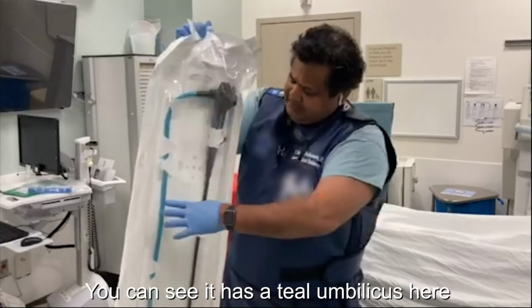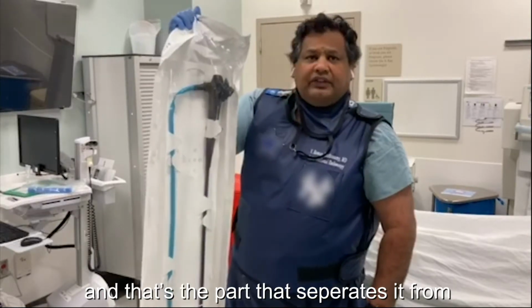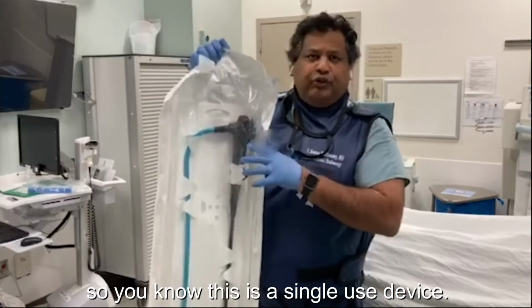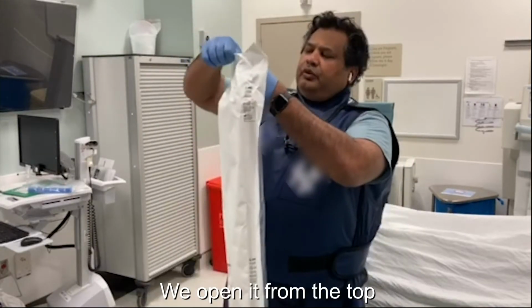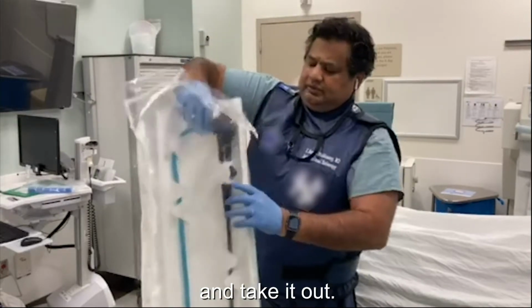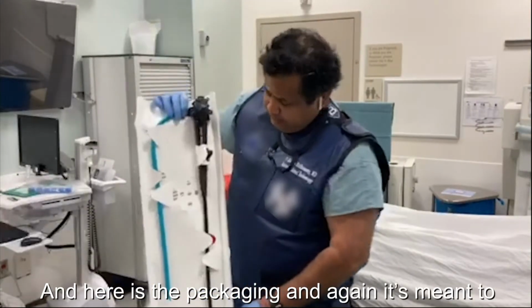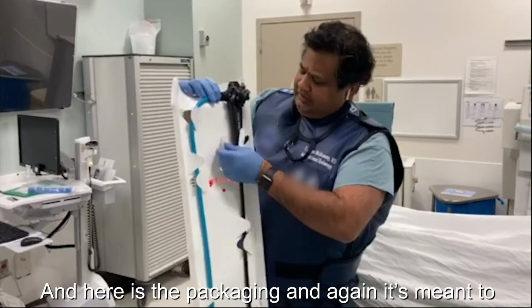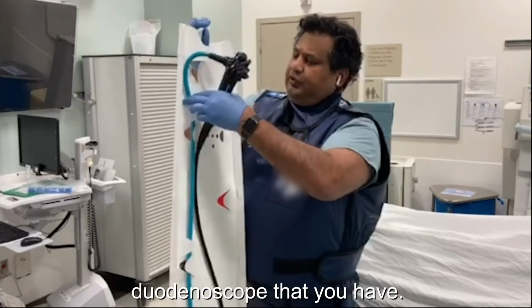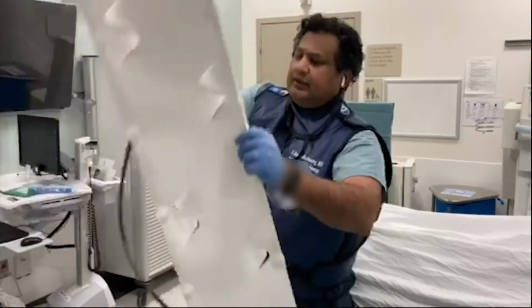You can see it has a teal umbilicus here, and that's the part that separates it from your standard reusable scopes, so that you know this is a single-use device. So we just basically open the top, and you can take this out. And so here's the packaging that we have here, and again, it's meant to essentially mimic the standard reusable duodenoscope that you have. We'll essentially separate it from the connectors here.